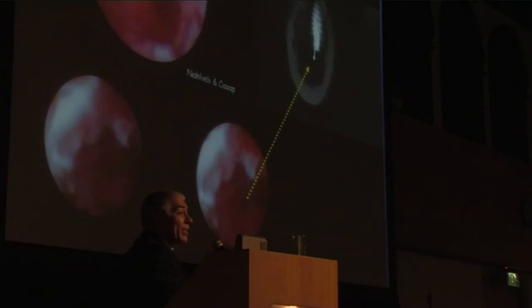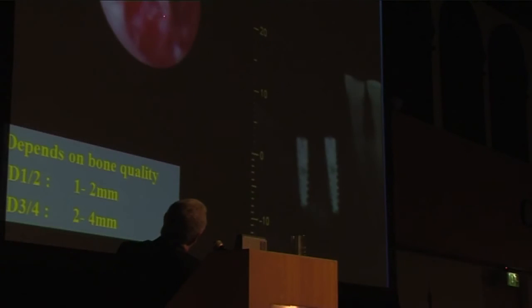And this is the results. We can observe the nerve with the endoscope. The bone reacts like a soft tissue, and as you can see here, we can see immediately, we can see the nerve. Here you can see the pulsating artery near the nerve.